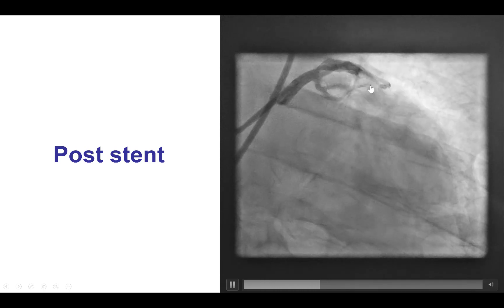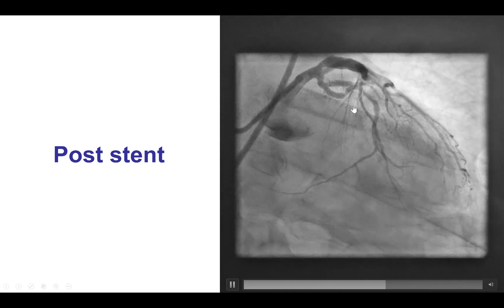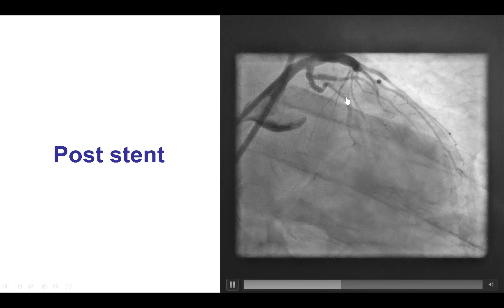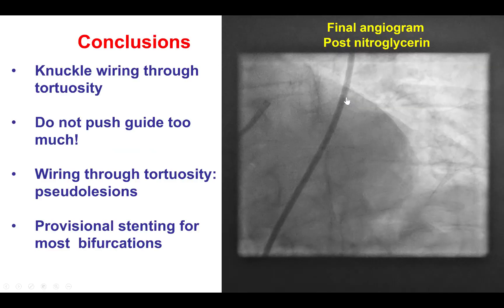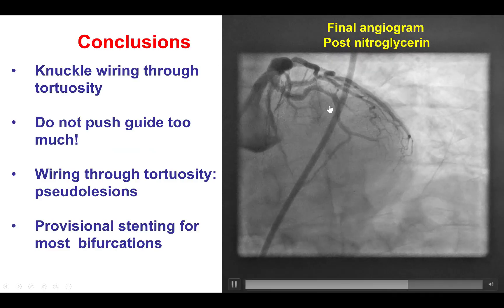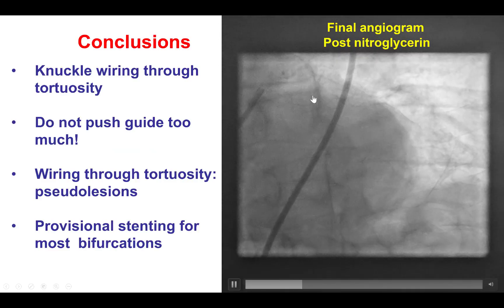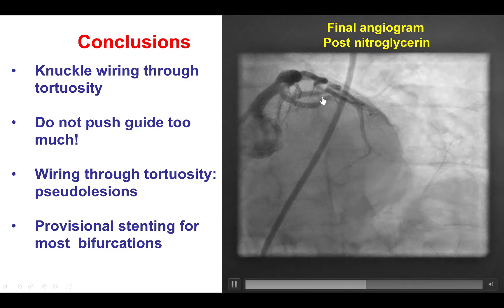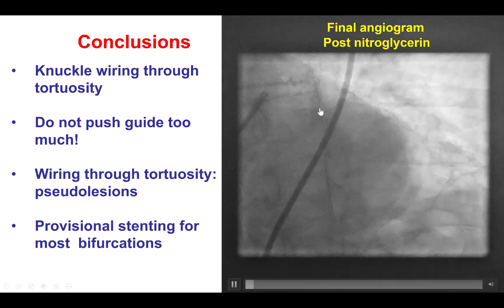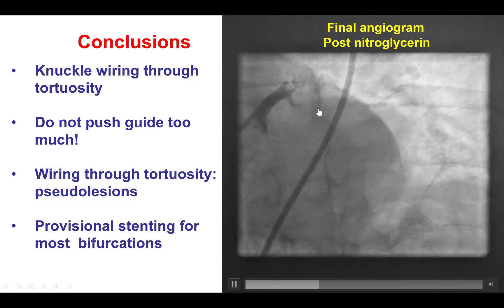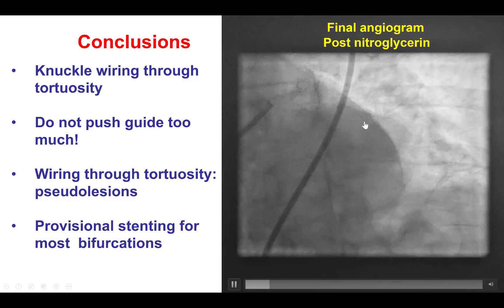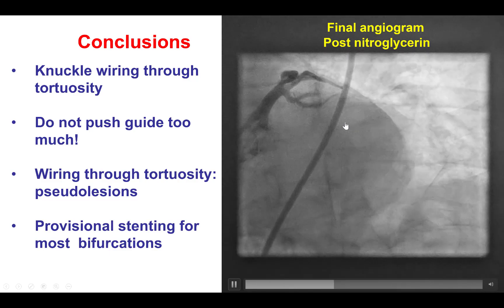We do have TIMI flow into the obtuse marginal branch. There is a lesion distally which could be spasm. So nitroglycerin was given, that significantly improved that disease, and it looks like this was actually spasm.